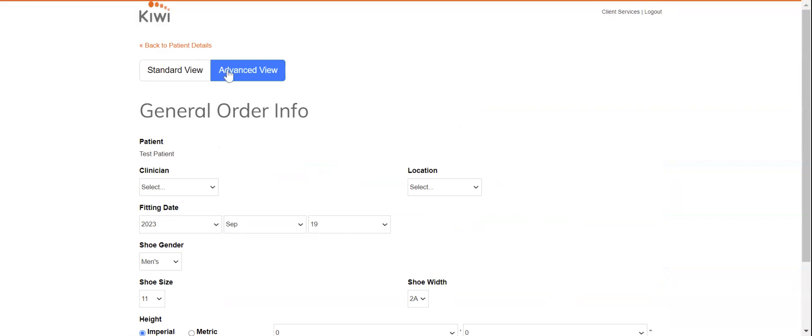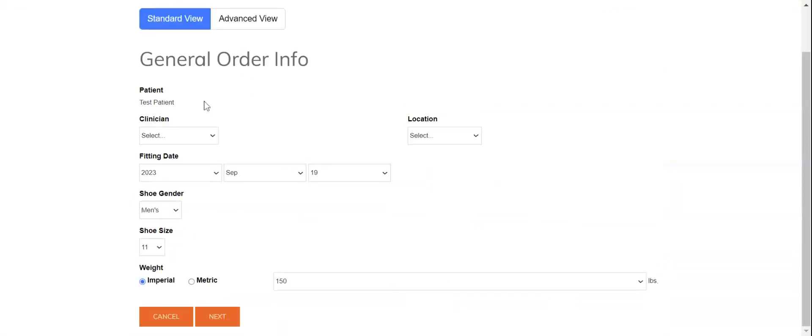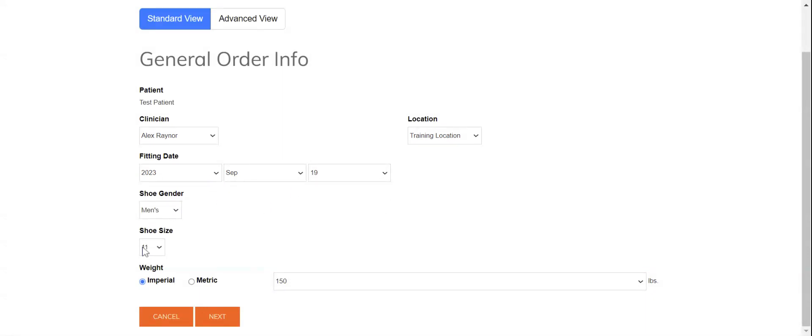On the first page I'm going to flick right over to standard view on the top left and put in my clinician information, location information, expected pickup date, and then of course shoe gender and shoe size as well as the patient's body weight.